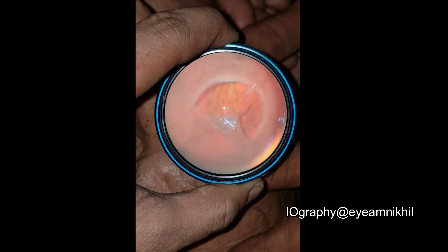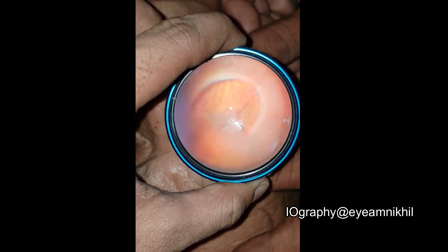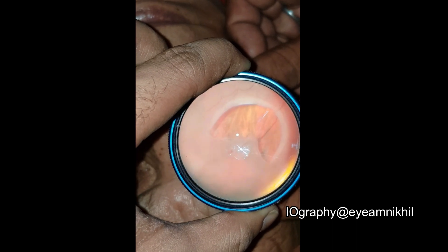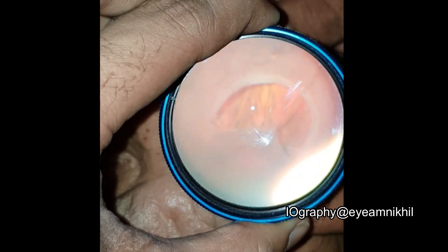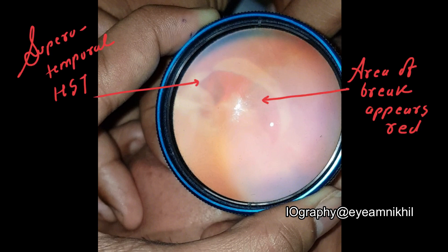What you see here is a large infero-temporal horseshoe tear in the right eye of the patient. This is another horseshoe tear located supero-temporally in the right eye. As you can see, the area of the break appears red because of the color contrast between the sensory retina and the underlying choroid.